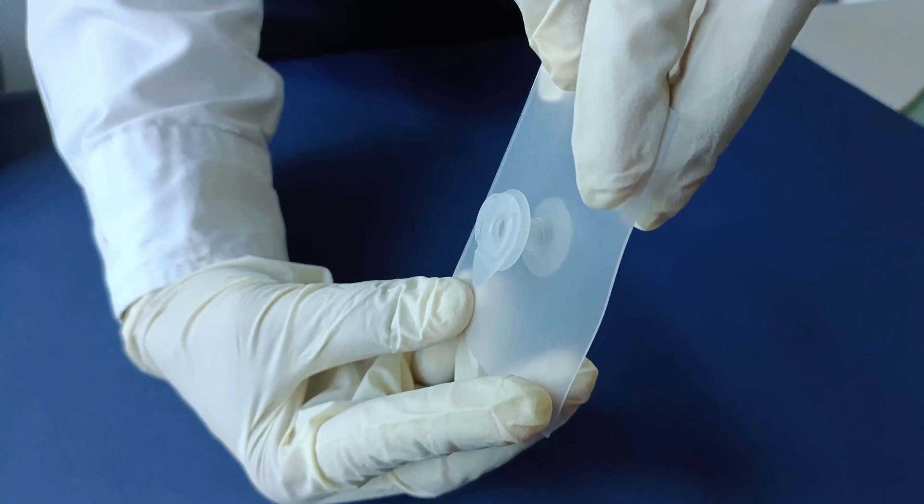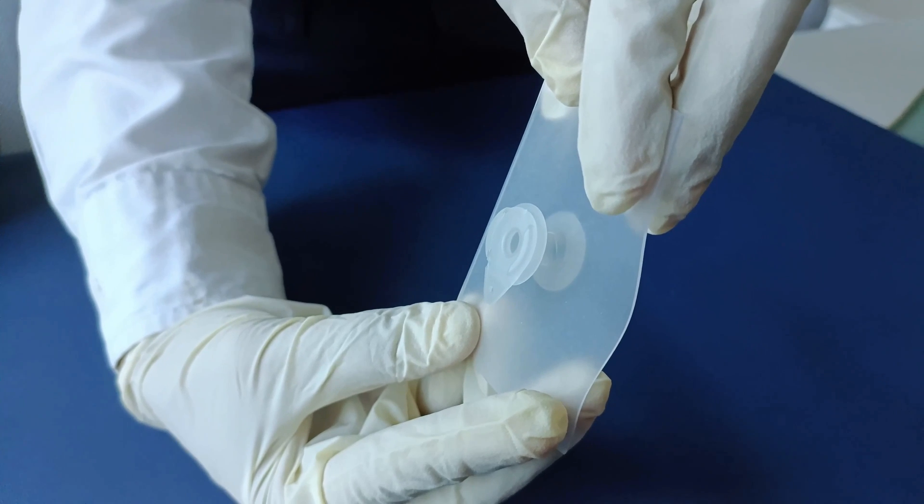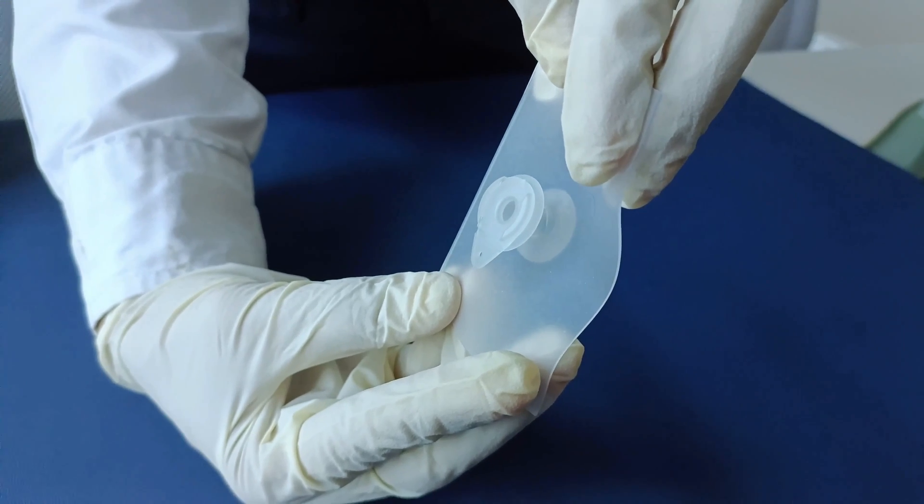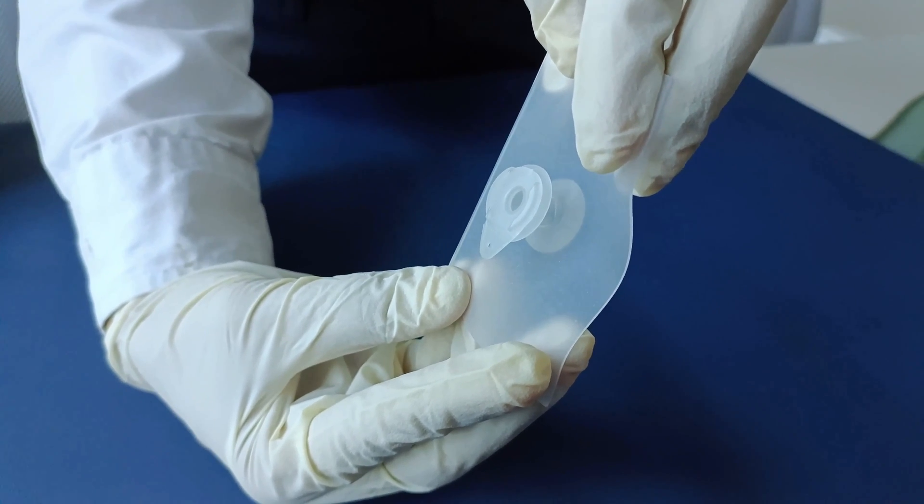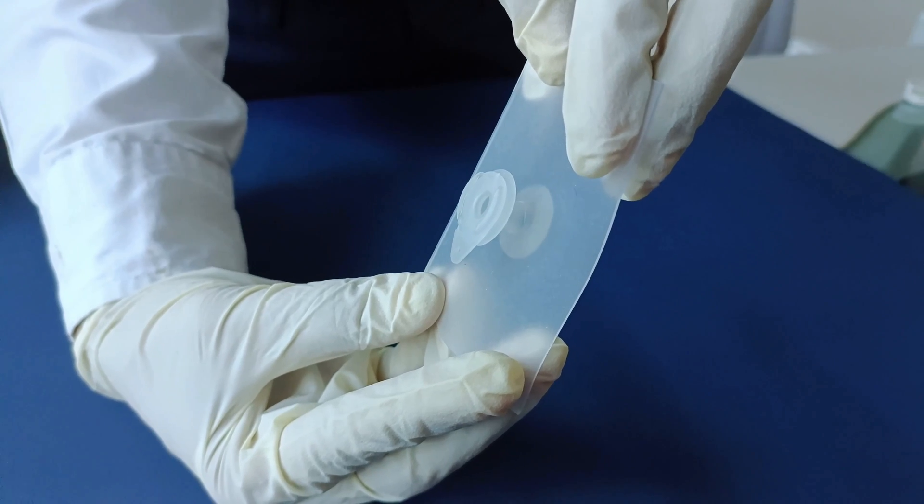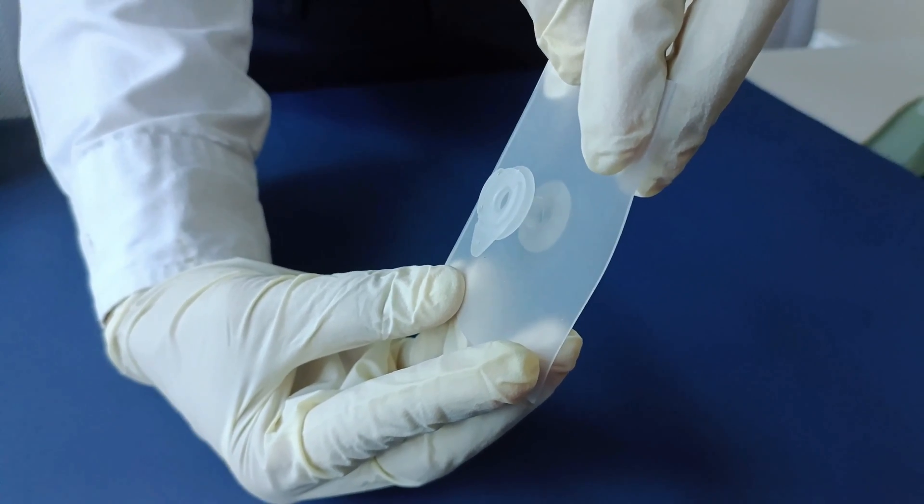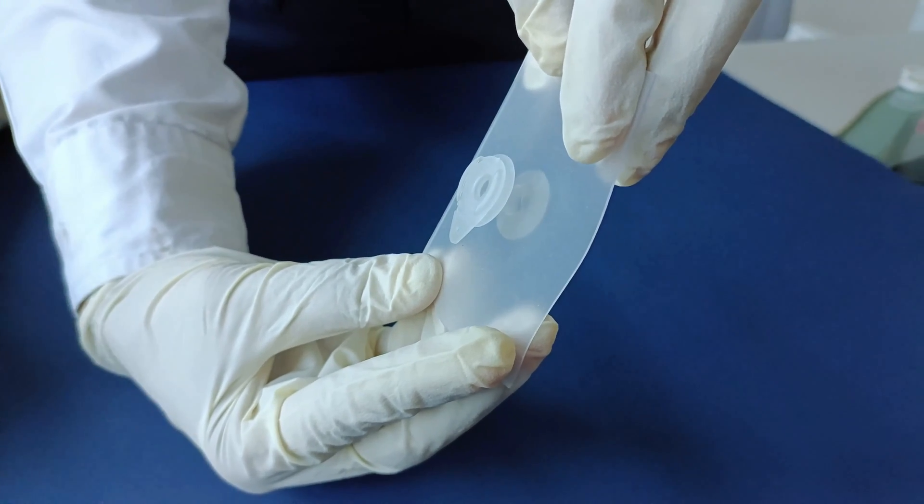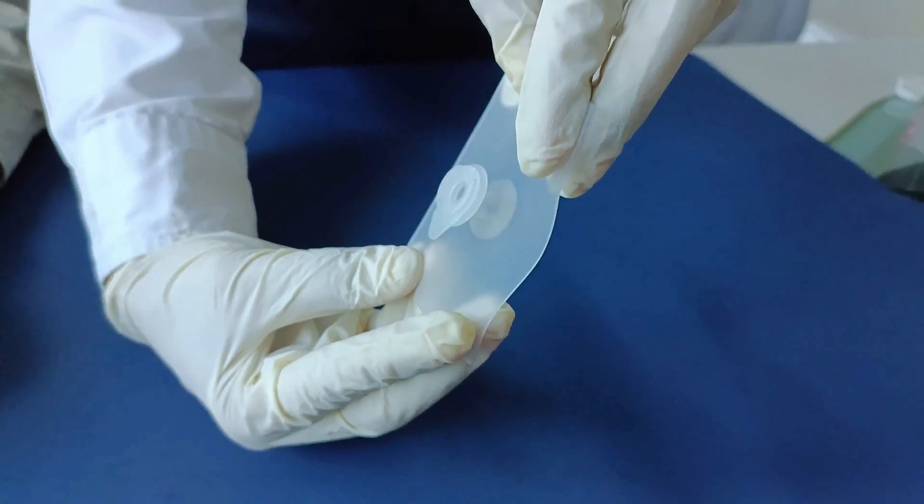Ensure that the outer cannula is positioned in such a way that the FR marking is visible on the top end with outer flange visible on the bottom end. Wait for 15 minutes for the gel cap to dissolve and the distal flange will automatically open installing the outer cannula with a perfect positioning grip.